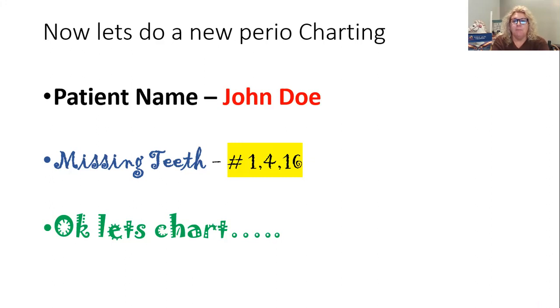You should have said mesial lingual 27. 2, 2, 2, 3, 2, 3, 3, 2, 3, 3, 2, 3, 3, 3, 3, 3, 4, 4. And we should be done. And again, now the doctor or the hygienist is going to go back and tell you any bleeding points or any recession that they might see in the gingival tissues. They're going to make any notations or get you to make any notations, anything that they might see in the patient's mouth at this point.